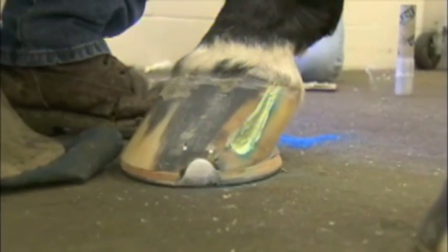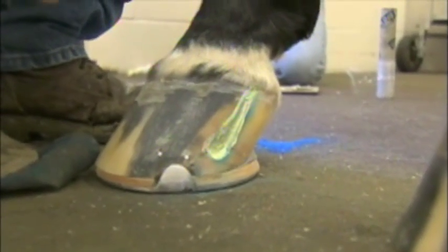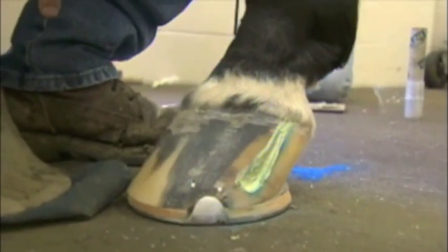First I cleaned out the crack with a Dremel, just got it good and cleaned out. And then I packed it off with a barrier — I used some Dical, or any kind of barrier or disinfectant powder over the bed of the crack.